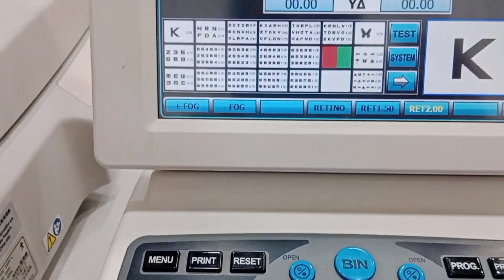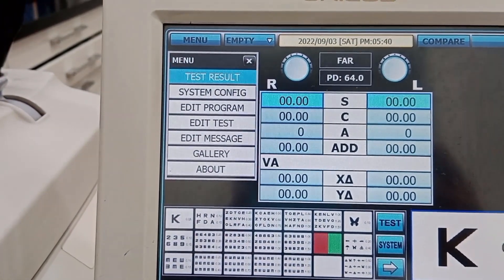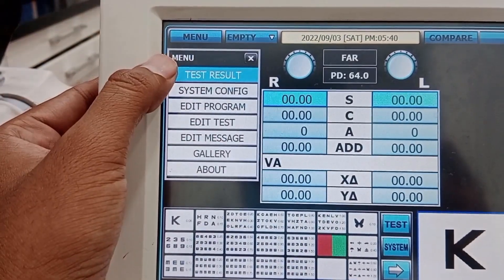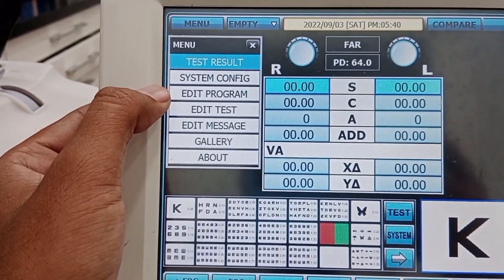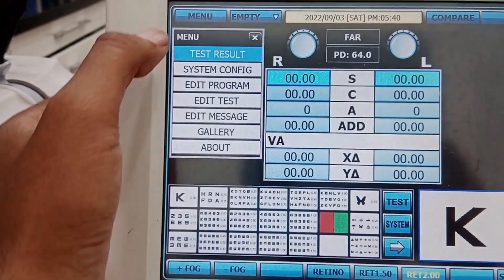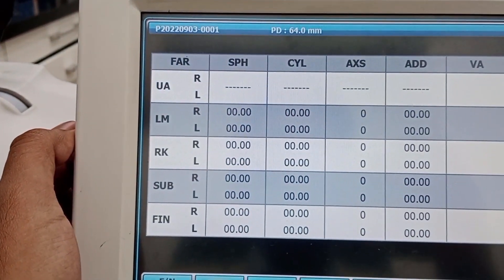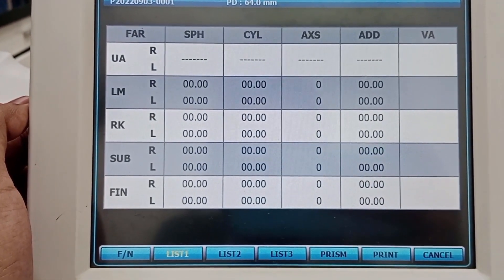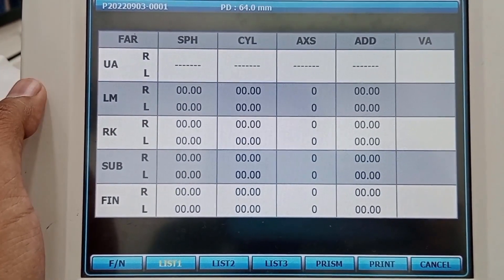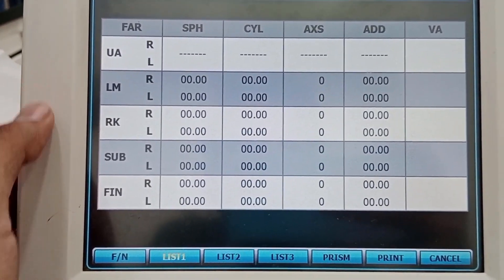You can see the screen carrying different settings like test results, system configuration, edit program, edit test, edit message, gallery, and more. If I press the button for test results, you can see spherical, cylinder, axis, addition, and visual acuity. You can save the history of the patient here or compare old and new prescriptions.